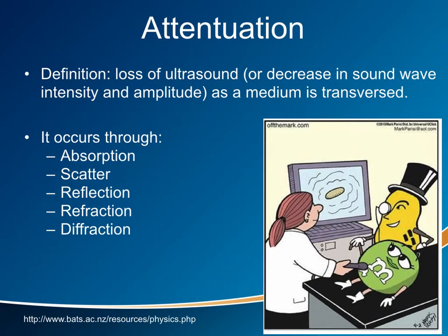You should also be aware of attenuation and how different components may affect the study you are performing. We will talk about these in a little more detail over the next couple of slides.